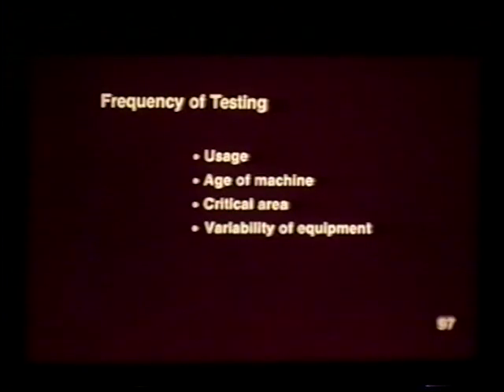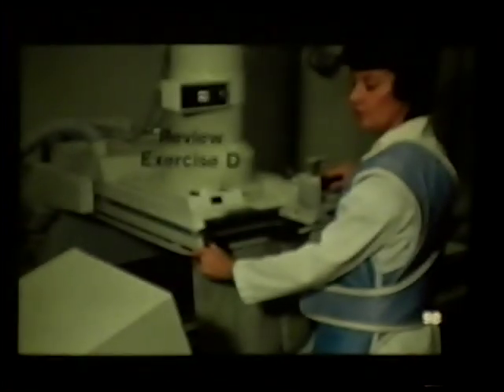The radiation protection devices, if they are handled carefully, need only be checked once a year. With the exception of the processor, most quality assurance tests can be scheduled on a 3-month, 6-month, or 1-year basis. A strict schedule should be adopted and maintained. Most tests can be performed during the slack periods of the day, causing as little disruption in the work schedule as possible.